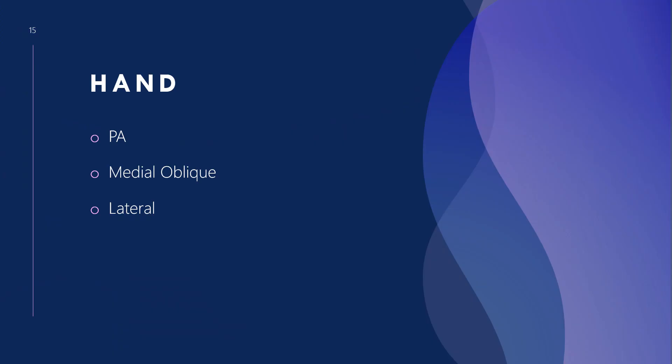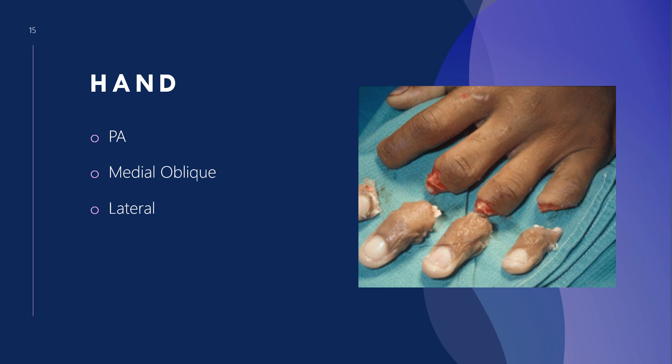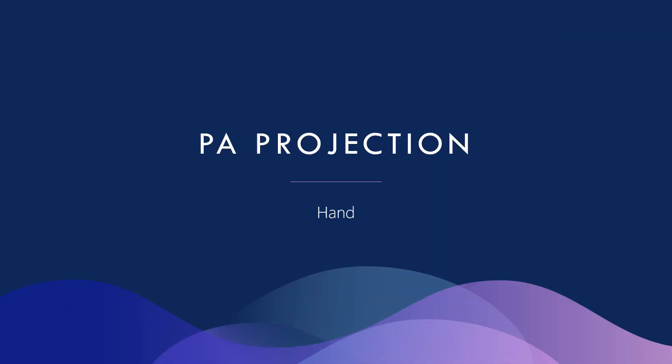Warning — I like to use graphic photos. This is an image of some digits that were cut off, showing PA, medial oblique, and lateral views. We'll discuss how we x-ray amputated digits in a little while.